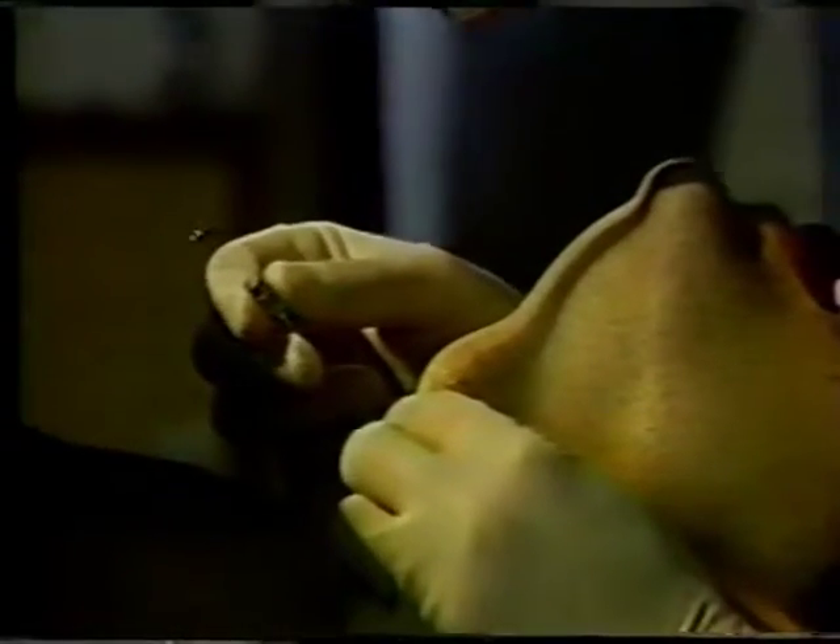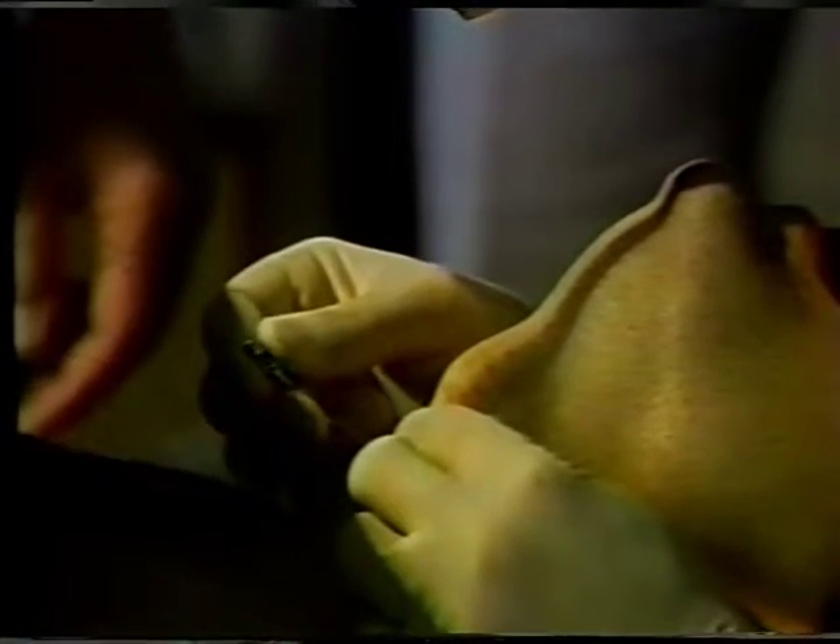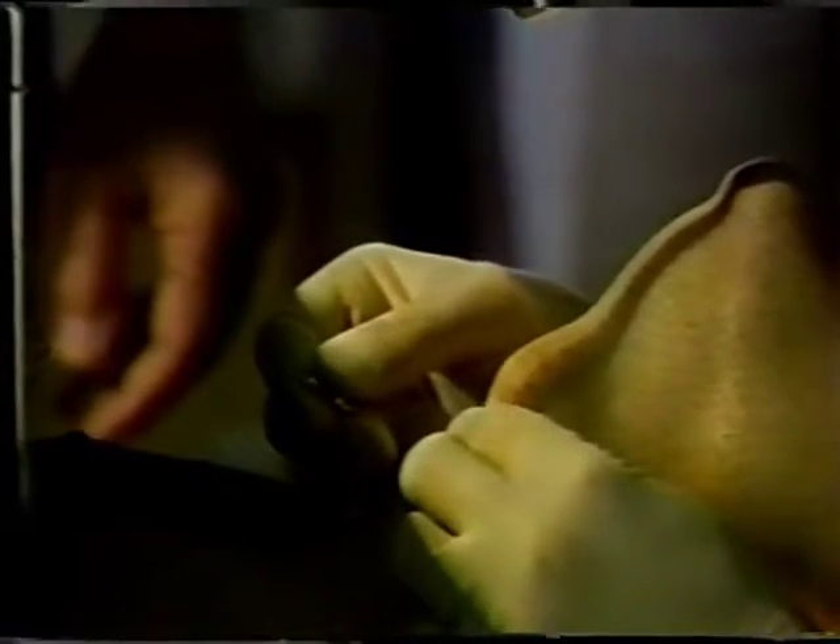The very fine wires used as electrodes are carried to the muscles by number 25 hypodermic needles varying in length from five-eighths of an inch to two inches. Seen here is the insertion of the needle through the cricothyroid membrane into the subglottal airway, where it is directed to the thyroarytenoid muscle.